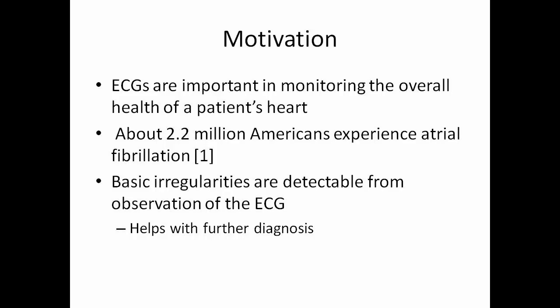So the motivation for this project includes that ECGs are very important in monitoring the overall health of a patient's heart. For example, about 2.2 million Americans experience atrial fibrillation in their lifetime. And also from observing these waveforms, we can detect basic irregularities in the ECG, such as bradycardia and tachycardia, which we'll look at further in this lab.